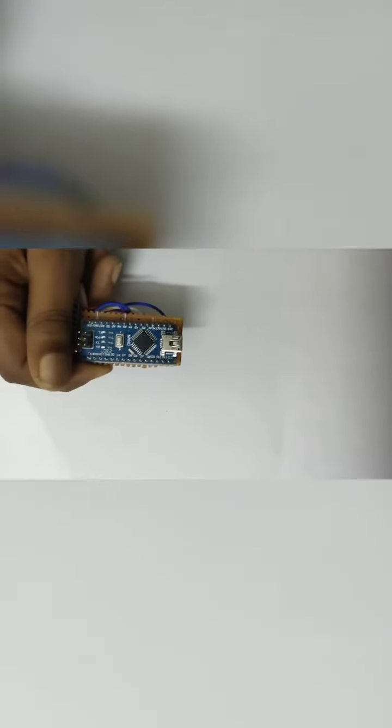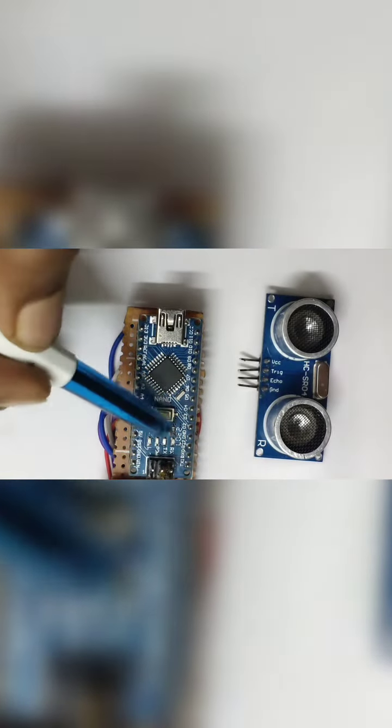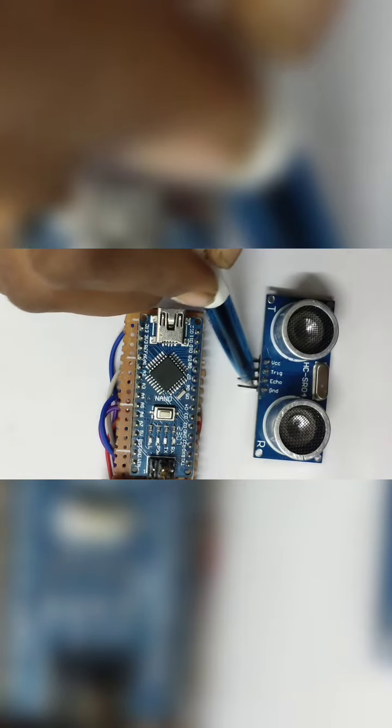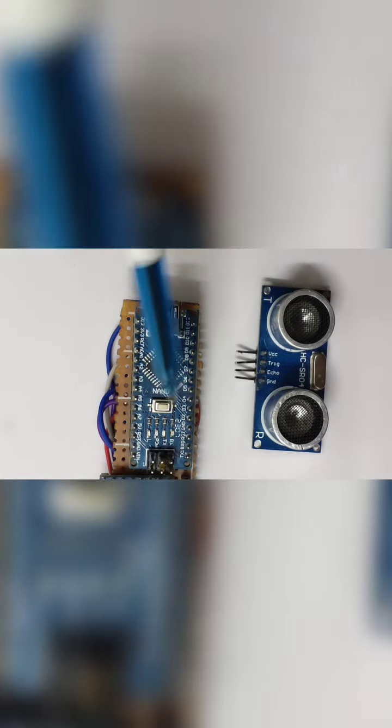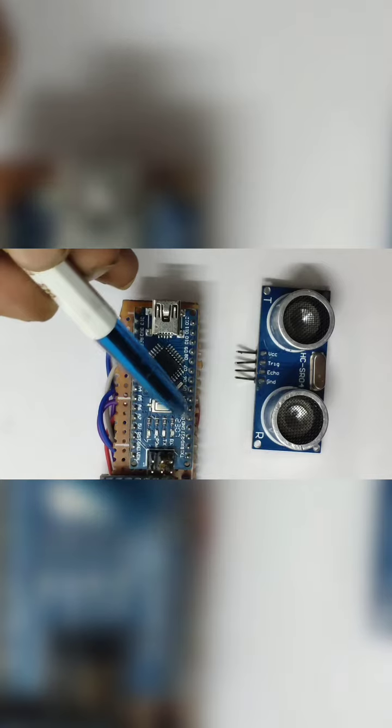Ultrasonic sensor, Arduino Nano, 3.7 volt battery, one black glass. Connections. Connect the GND pin to the GND of the ultrasonic sensor. Then connect the echo pin to the Arduino D2.